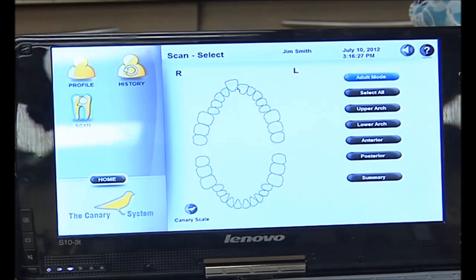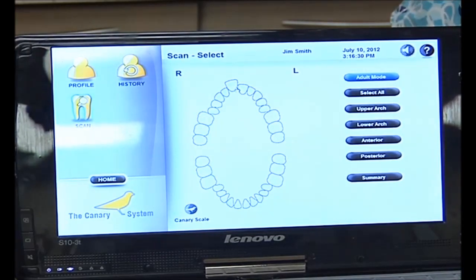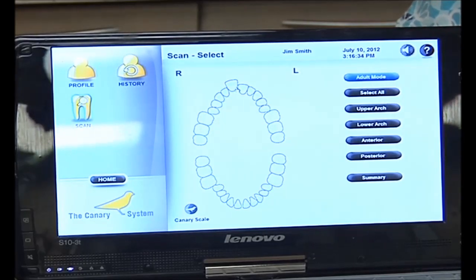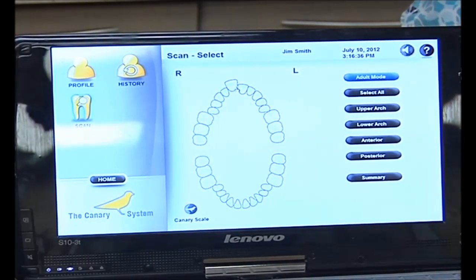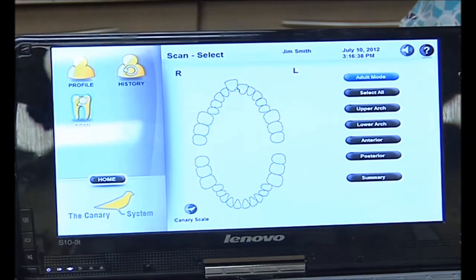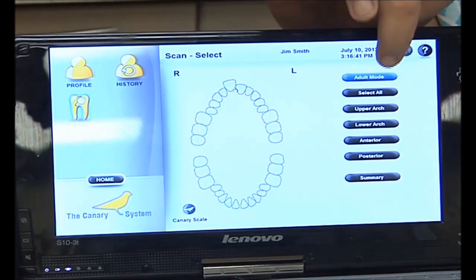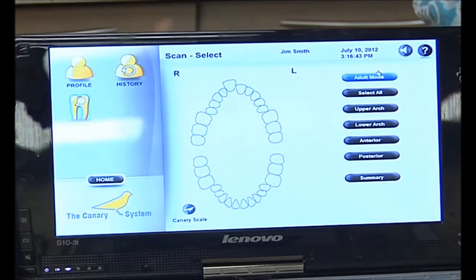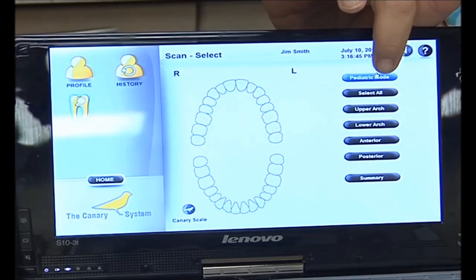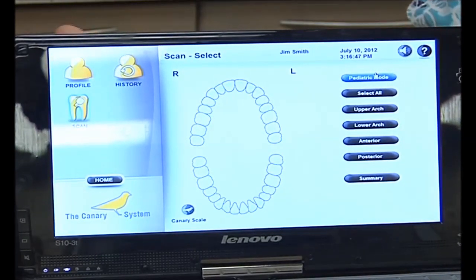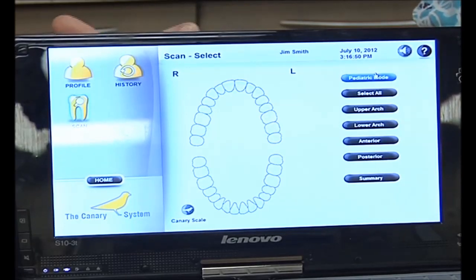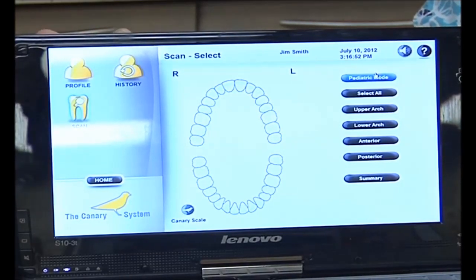For young kids, it's great for working with those who can't have x-rays taken. It's also great for working with special needs patients who can't tolerate x-rays, and for patients who will not have x-rays taken. When we are doing a detailed scan, we just tab the teeth that we want to use for a scan.